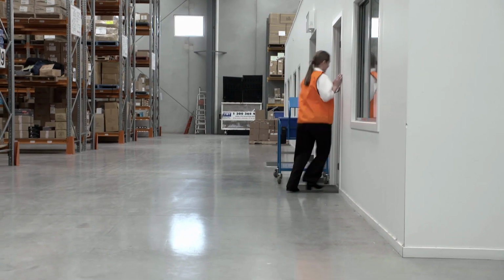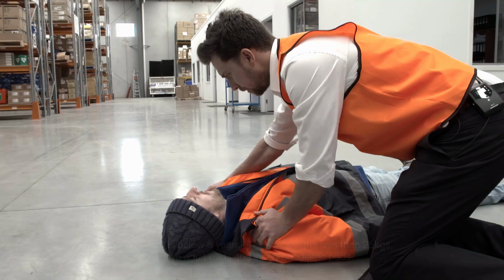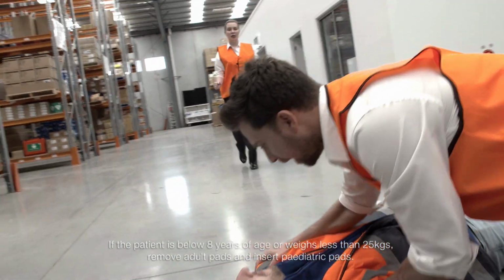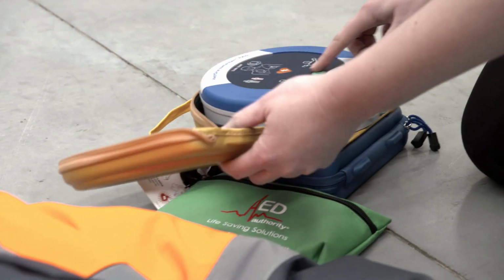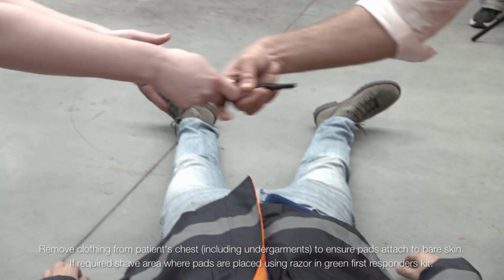The Heartsine 500p is simple to operate and will guide and coach you through the rescue with easy-to-follow verbal and visual prompts. If the patient is below 8 years of age, you should remove the adult pads and insert pediatric pads. Press the green on button to turn on the defibrillator. Call for medical assistance.